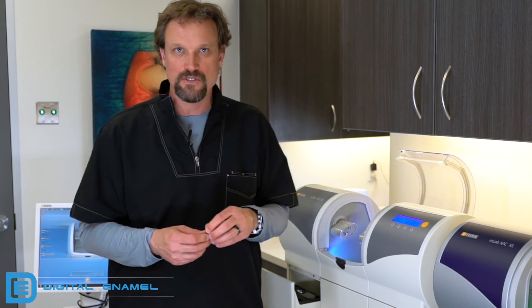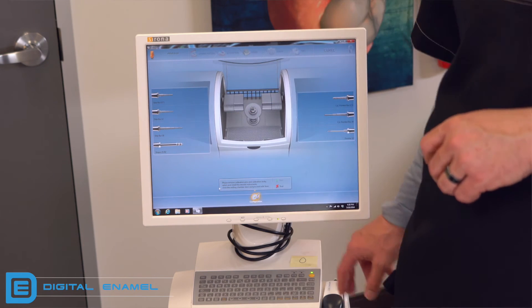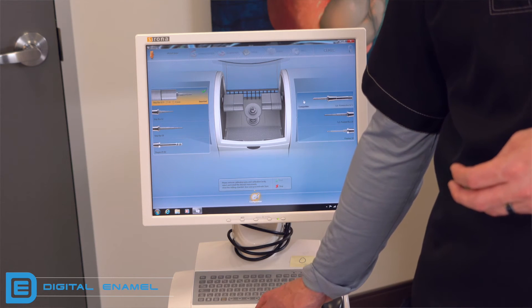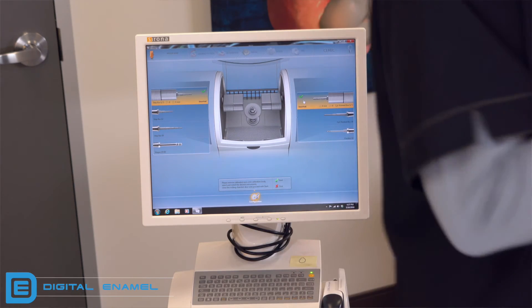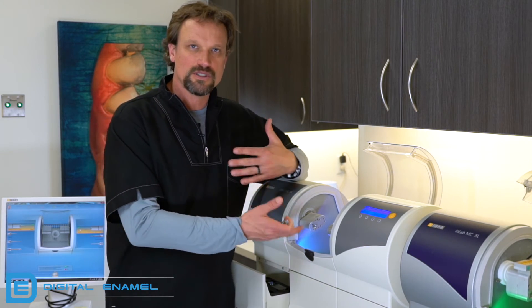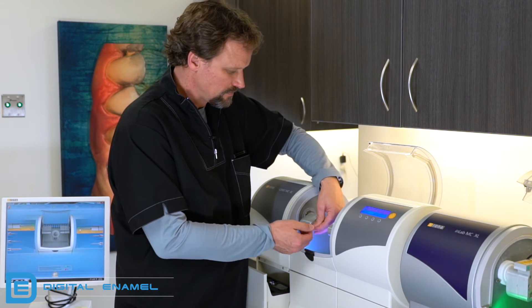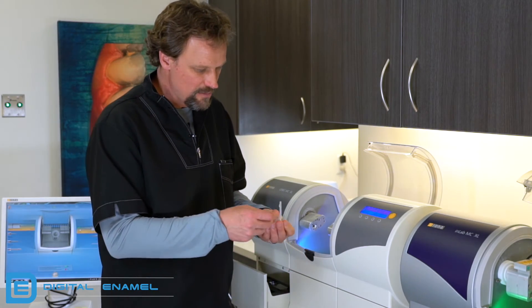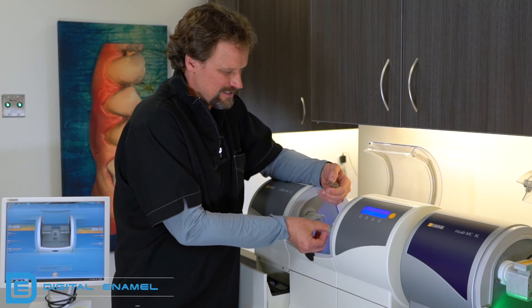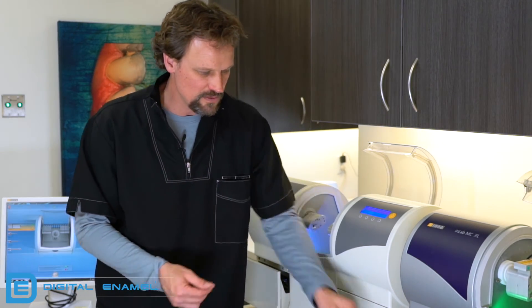We need to put our burrs back in. If you look at the software, it gives you the options for burr changing — we're going to select which ones we put back in. It's a 12S, or whatever burr you used before. Select them in the software and go back to the milling chamber. If you hit start, the system thinks you've already changed the burrs, so don't hit start yet. Take out the calibration pins — lefty-loosey — and put them back in their little plastic case. We don't want to lose those.